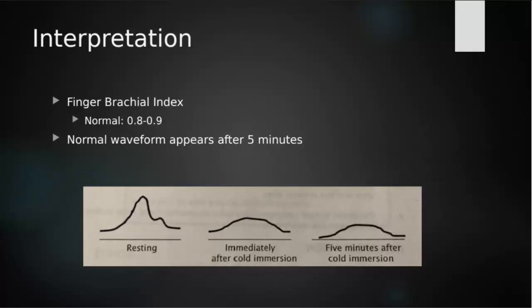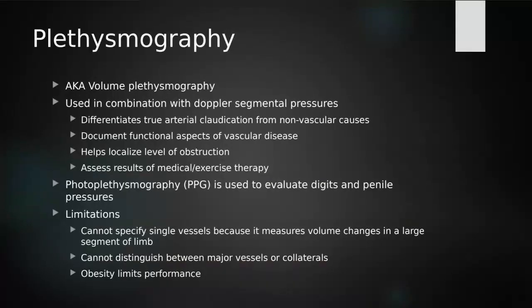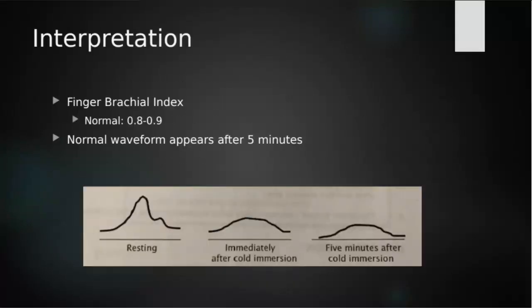Here's the information for interpreting a finger brachial index. If we were to do the finger stress test, pretty straightforward. And I should say that this is the normal appearance here at the bottom.